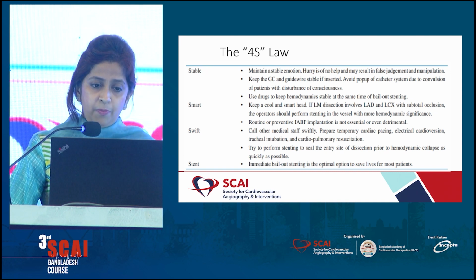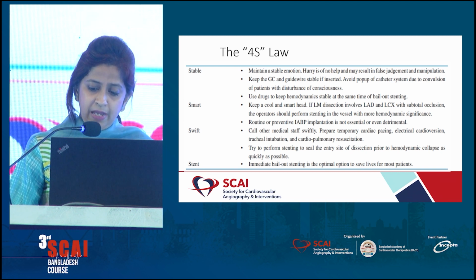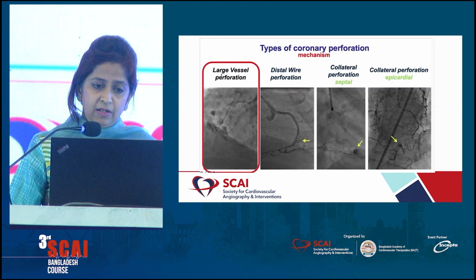The operator should be emotionally stable. The patient should be kept hemodynamically stable. Both the guide wire and guide catheter should be stable, and the operator should be clear-headed and take the right decision, and he should be swift to call the other medical staff. Ultimately, stenting is the bailout strategy.